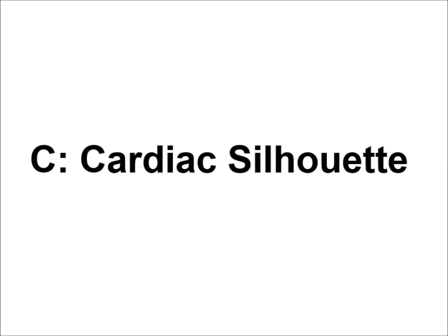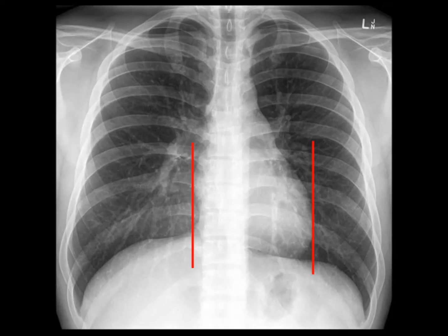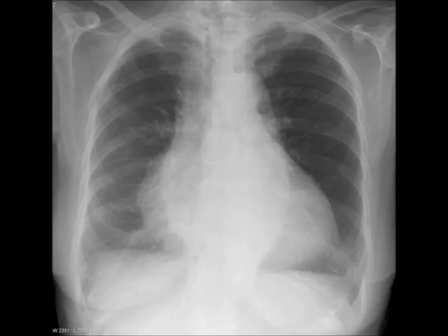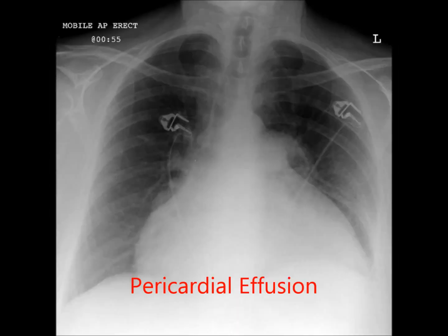C is the cardiac silhouette. On a PA film, the heart should be less than half of the chest width. An enlarged cardiac silhouette is most commonly caused by cardiomegaly. Pericardial effusion is another important cause.